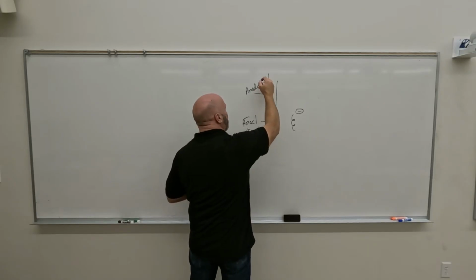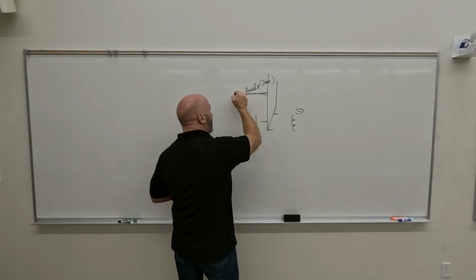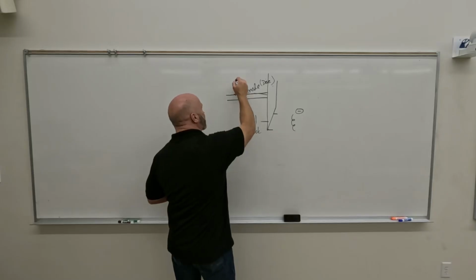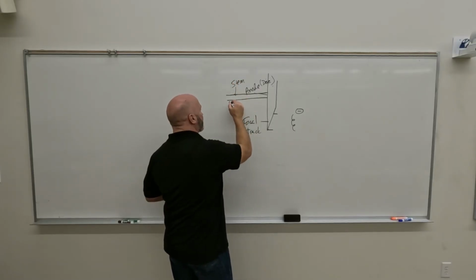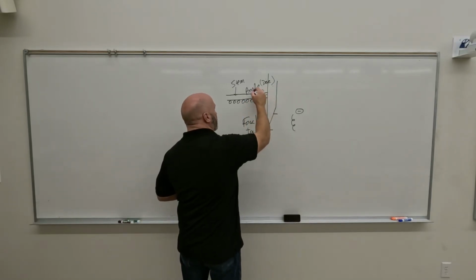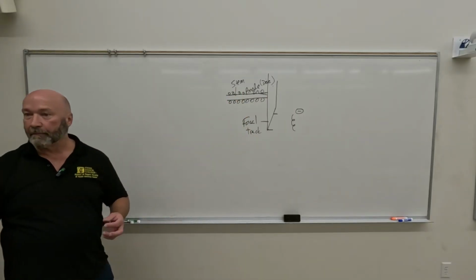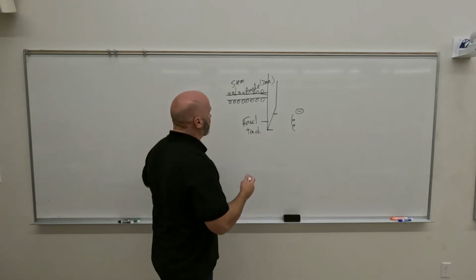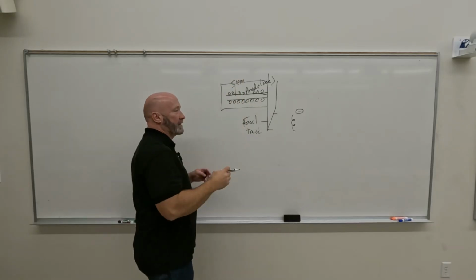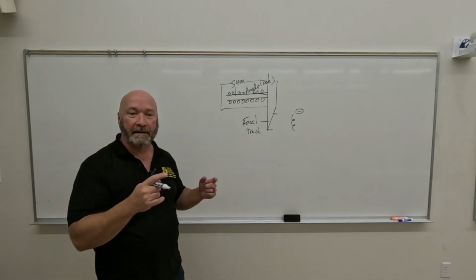So what we've got is, I'm going to put in parentheses, disc, but you got to have something for it to rotate on, right? So that's going to involve 2 different things. One is a stem, and then the other would be some sort of bearings for it to rotate on, okay? So when you rotor up, what you do is you activate that induction motor that I brought down, right? So the induction motor slips over, you got the glass that surrounds all this, and the induction motor is considered to be a portion of the X-ray tube, but it's not in the X-ray tube. It's in the housing, but it's not in the X-ray tube.